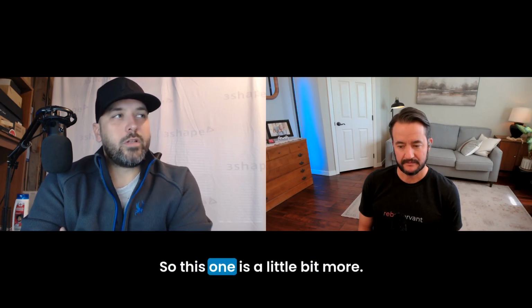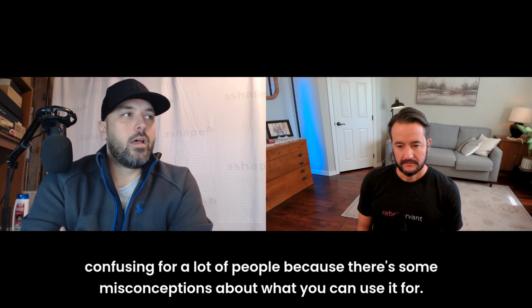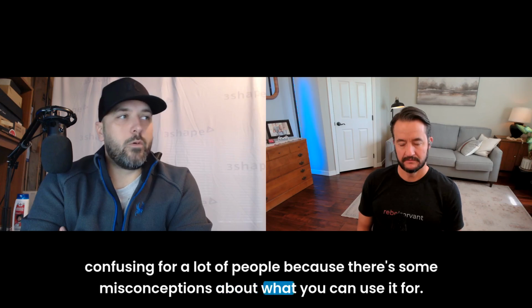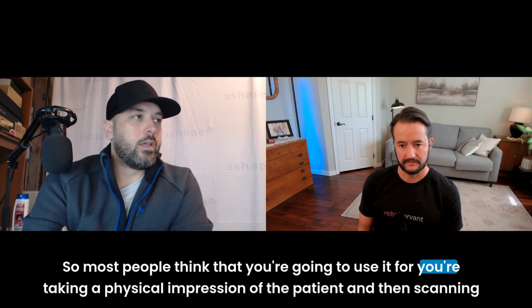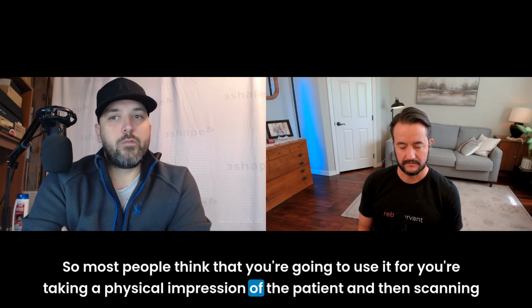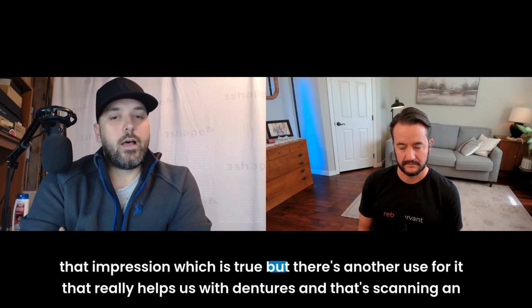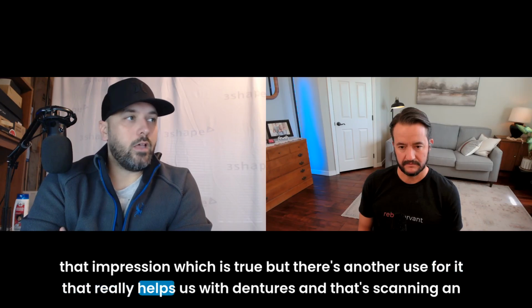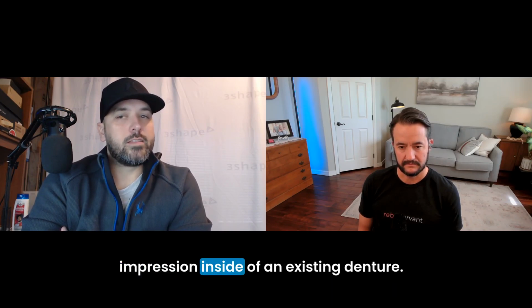So this one is a little bit more confusing for a lot of people because there's some misconceptions about what you can use it for. So most people think that you're going to use it for taking a physical impression of the patient and then scanning that impression, which is true. But there's another use for it that really helps us with dentures, and that's scanning an impression inside of an existing denture.